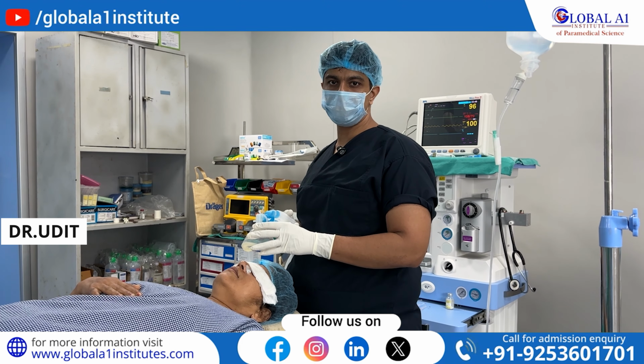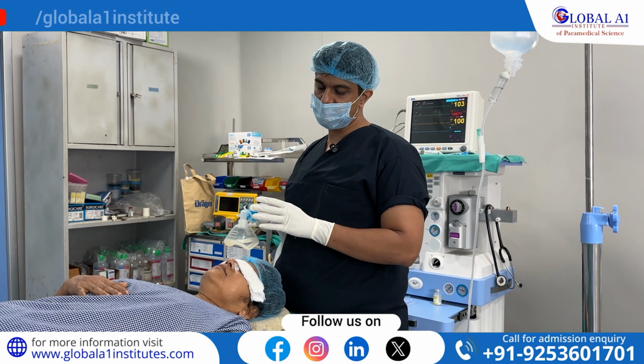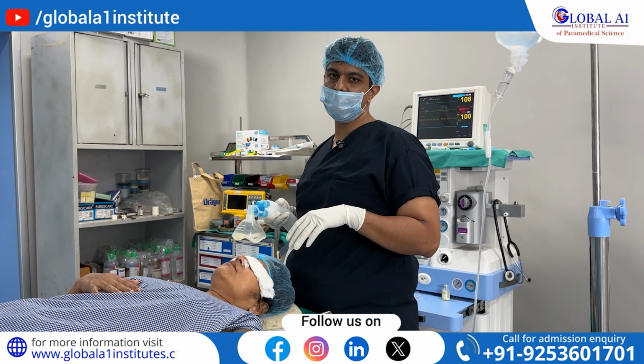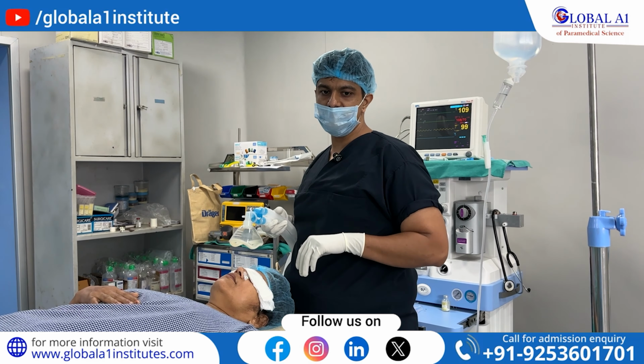Good afternoon, myself Dr. Udit. I am the anesthetist. We are starting with the general anesthesia. As you can see, it is a circuit. It is attached to the anesthesia workstation. It is an elective case of right side clavicle fracture. So we will be doing it under the general anesthesia, right?